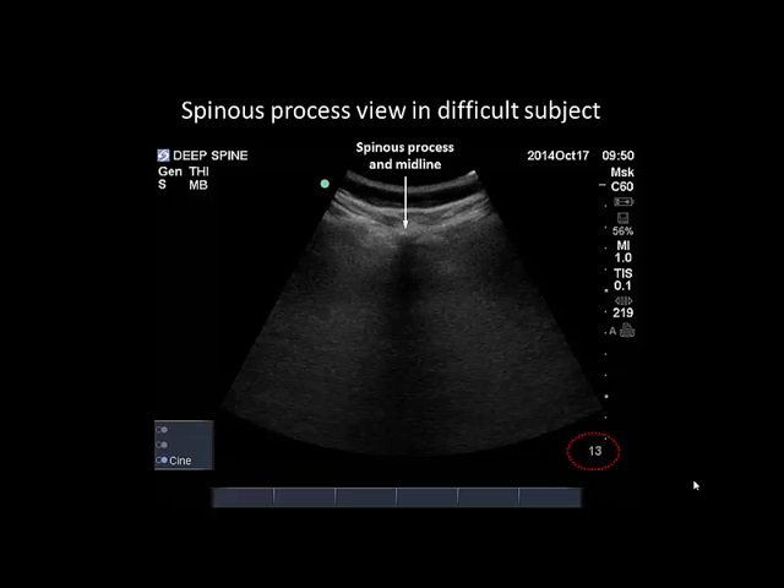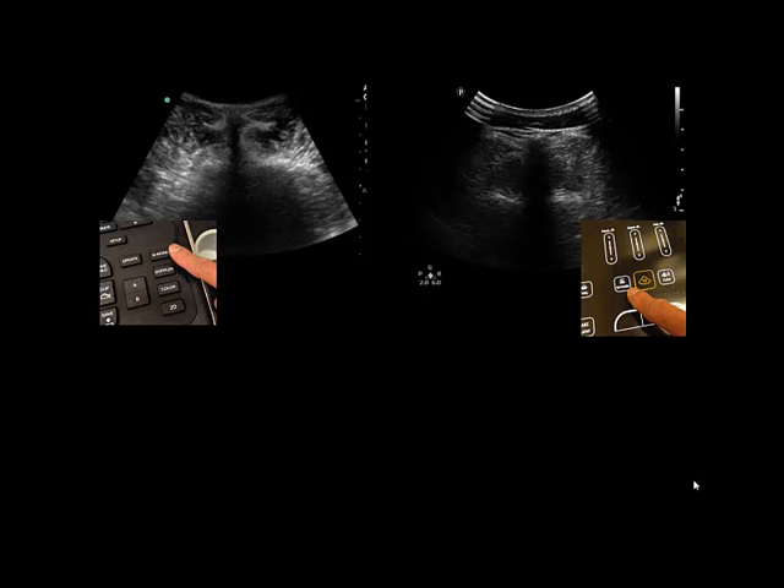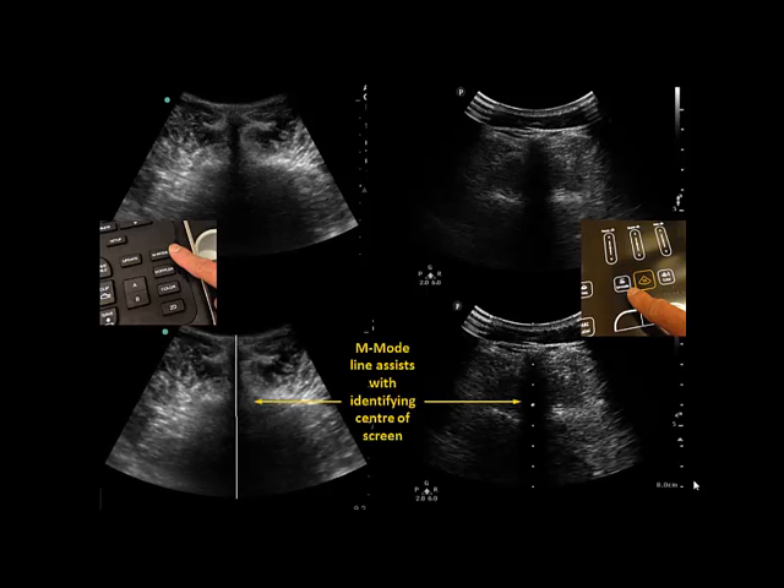This transverse spinous process view is the only view that is necessary for the ultrasound-assisted paraspinous approach. Once a spinous process view has been obtained, its acoustic shadow is centered on the midline of the screen. In most machines, pressing the M mode button calls up the center line that can be used to help with this centering process. The accuracy of this and the subsequent skin marking are essential to the success of the paraspinous approach.